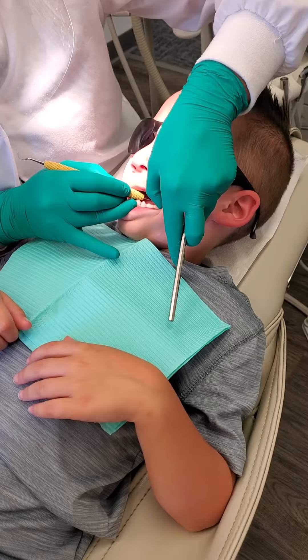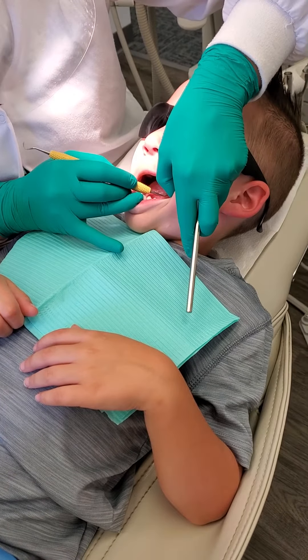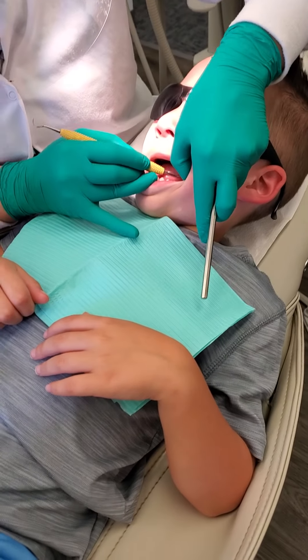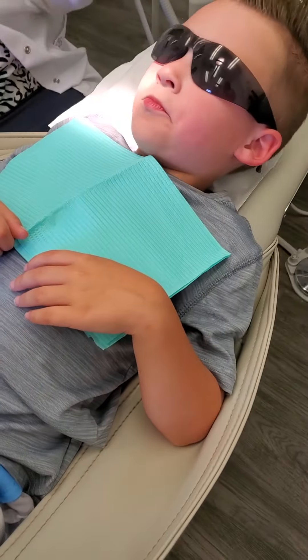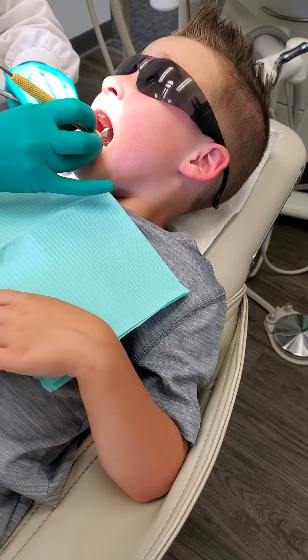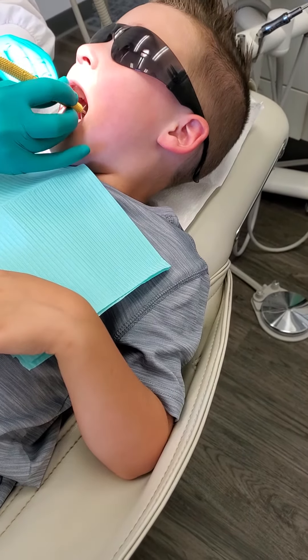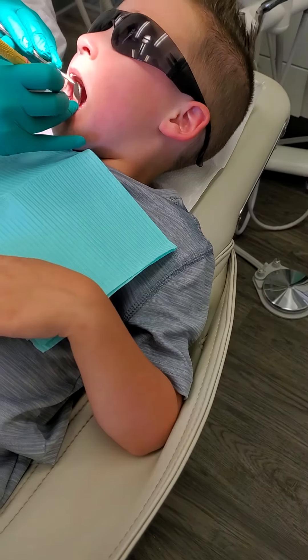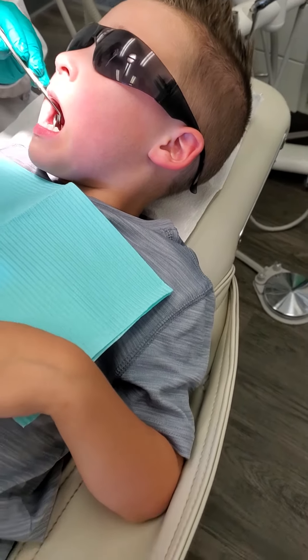Wait till they're all clean and then they feel really nice and good. Is he getting a molar back there on that side, or just the other side? There's a little formation groove there. You're doing so good, bud.